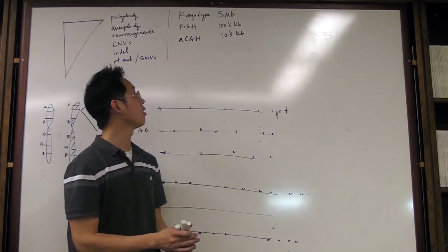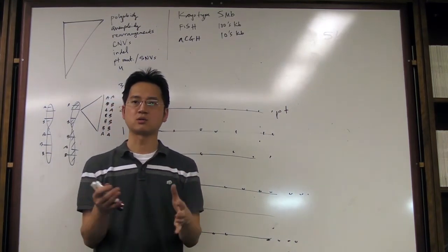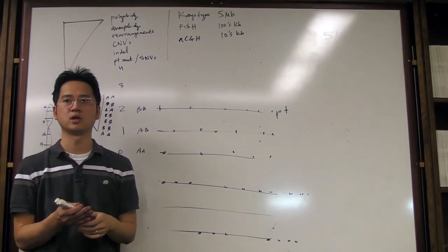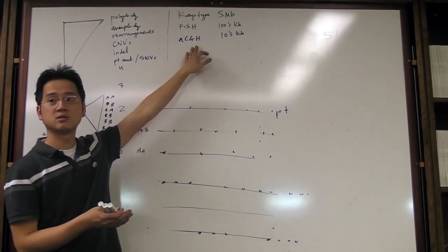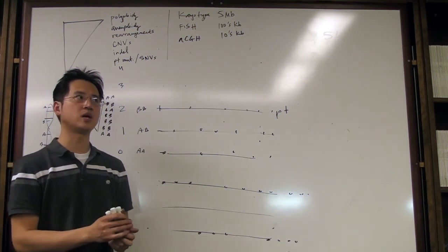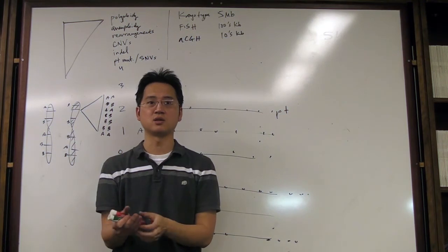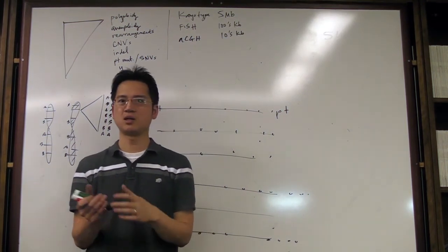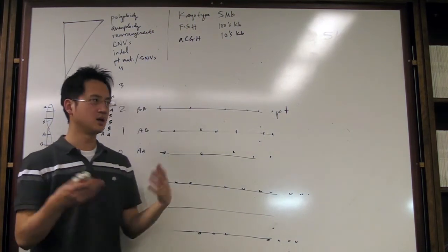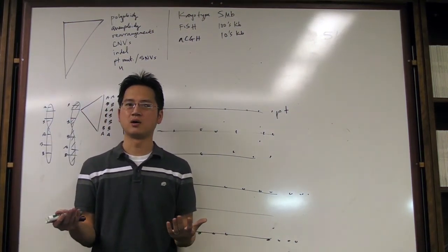But I think the power in terms of the sensitivity of this assay for this particular type of group, at the 10-15% level, is very well worth it. It's also an expensive assay to do, and a lot of times the pickup that you get is diagnostic for a condition. Most of the time it's not going to give you an answer about how to treat the condition, because a lot of these conditions affect 5 million bases, 10 million bases. You're not going to be able to repair that very easily.